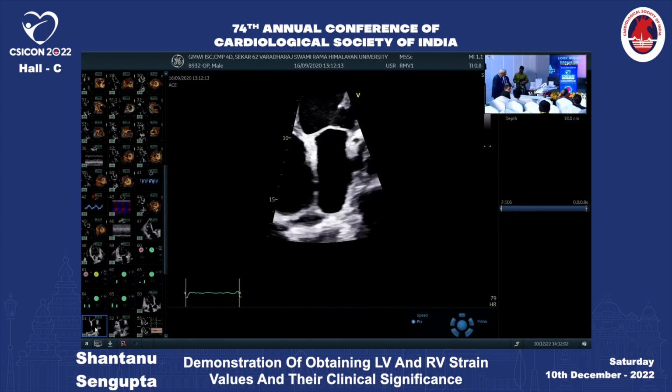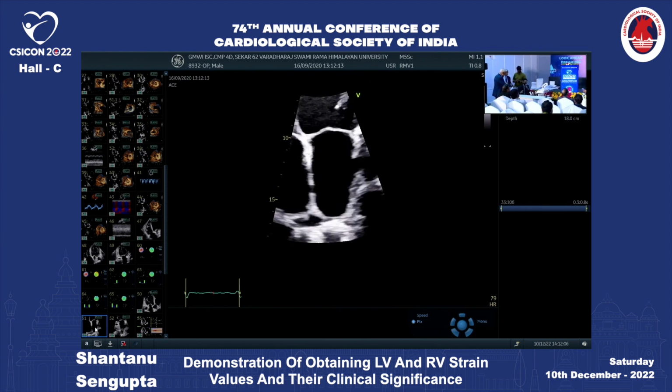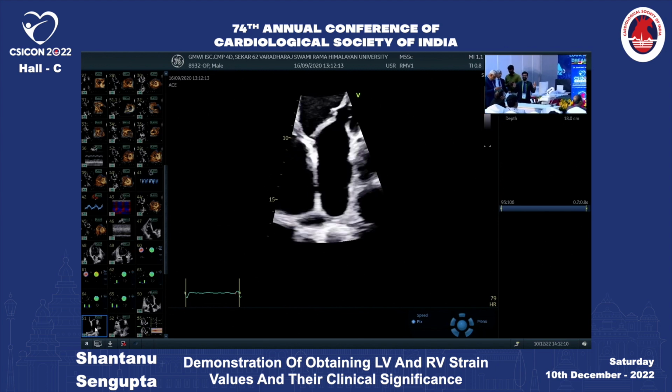Okay, I will quickly show. So, a couple of things. Am I audible? Okay. Whenever you do an LS strain, there are two schools of thought, and now the ESC guidelines have come up on how to do it.